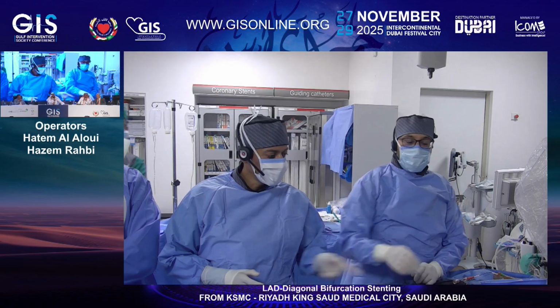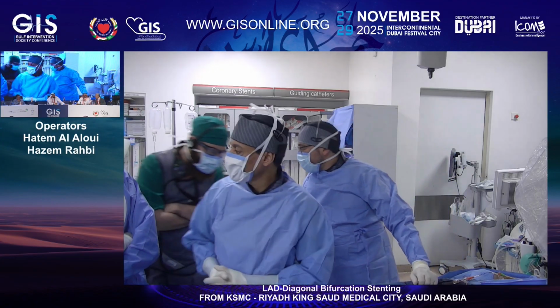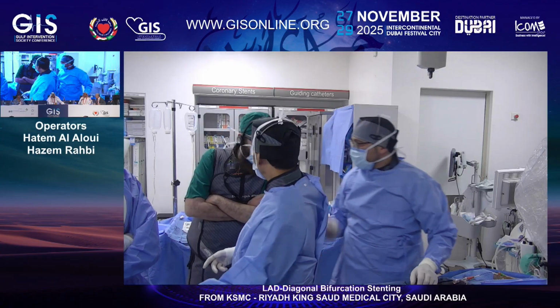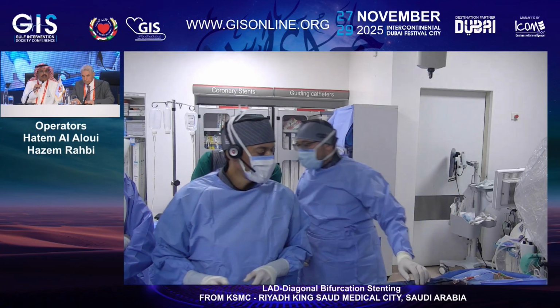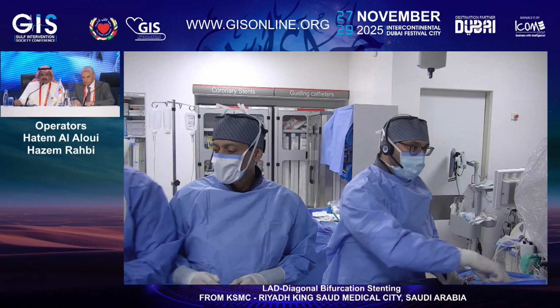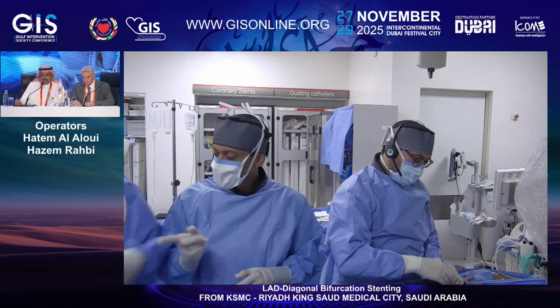Well, as you know, recently the literature has supported using IVUS in bifurcating lesions, and supported using imaging in the bifurcating lesions.